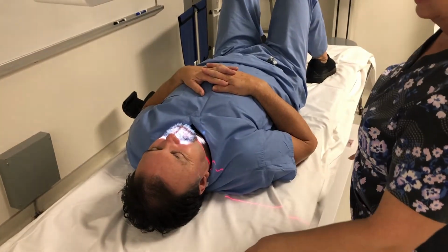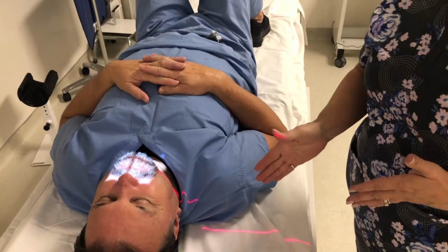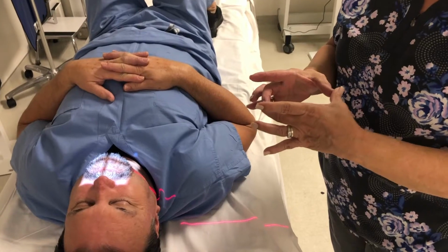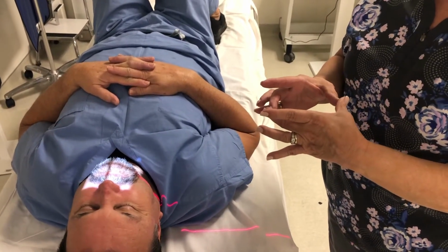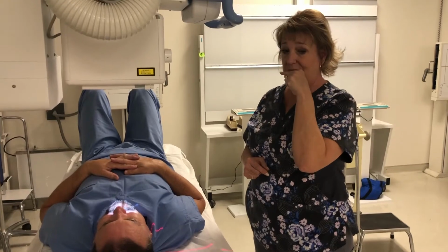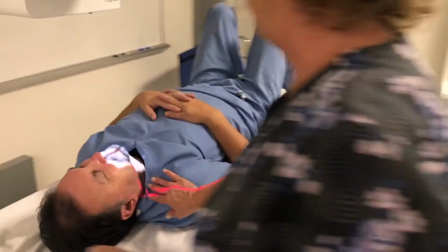In order to decide how this projection is going to center his atlas and axis in the center of his open mouth, I have to look at what they call the occlusal plane. So I'm going to draw an imaginary line from the bottom of his upper teeth to the mastoid tip, which is right behind his ear.